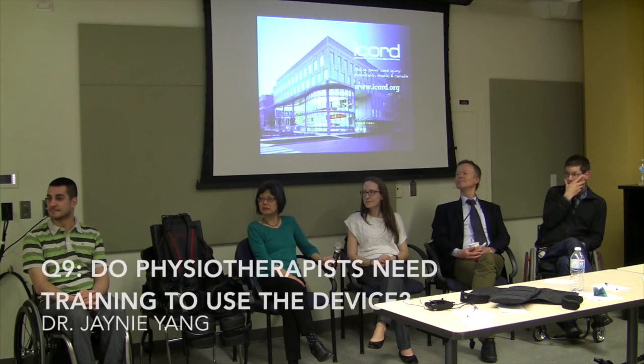Awesome. Next question: do physical therapists need training to use the device, and if so, what type of training? Each company has their own system. Yes, you need training. In the ReWalk system, they don't require that it be a physical therapist. They just call them trainers. But I do think that having a physical therapist there is useful because of all the other things that go with spinal cord injury. The training is not very intensive. It takes about 2 or 3 days. It's not that long. So we trained within half a week or so.